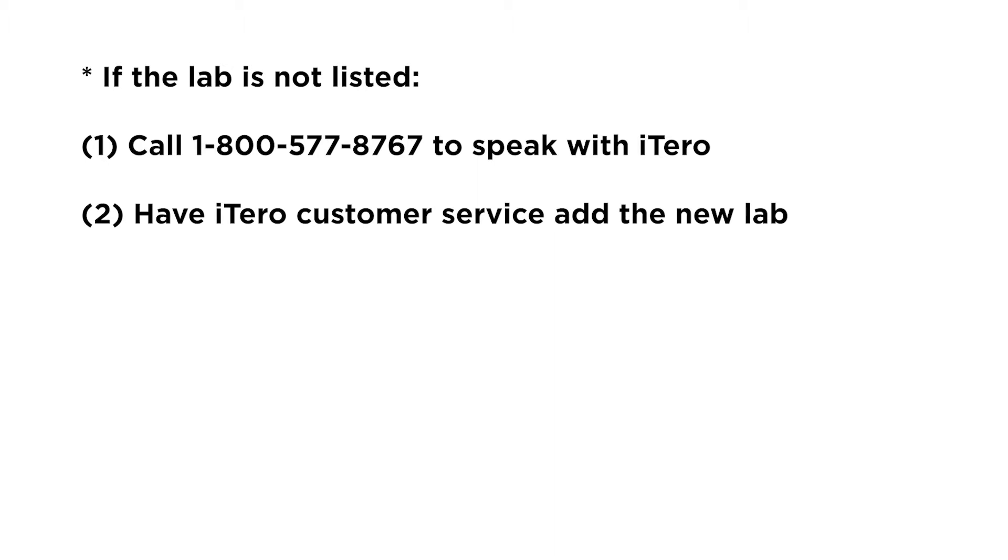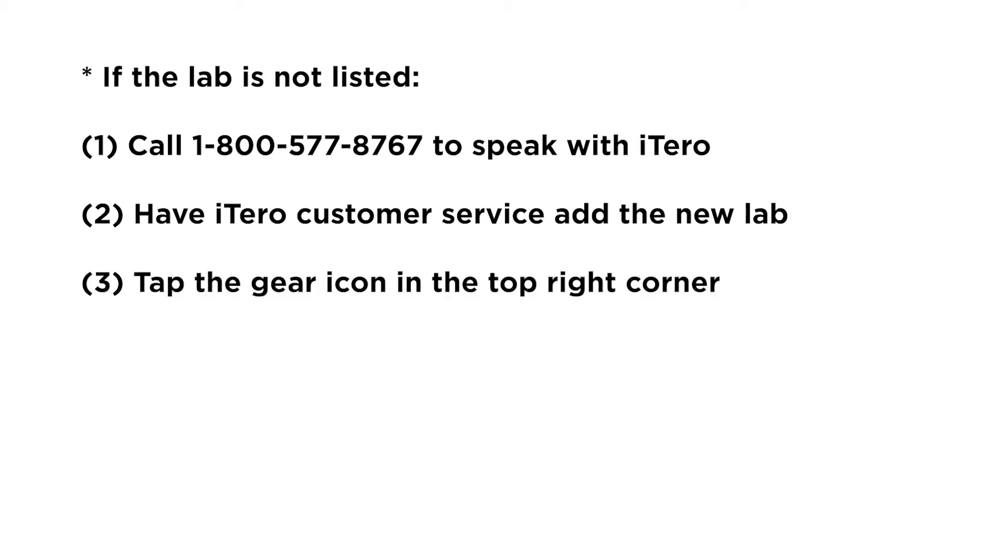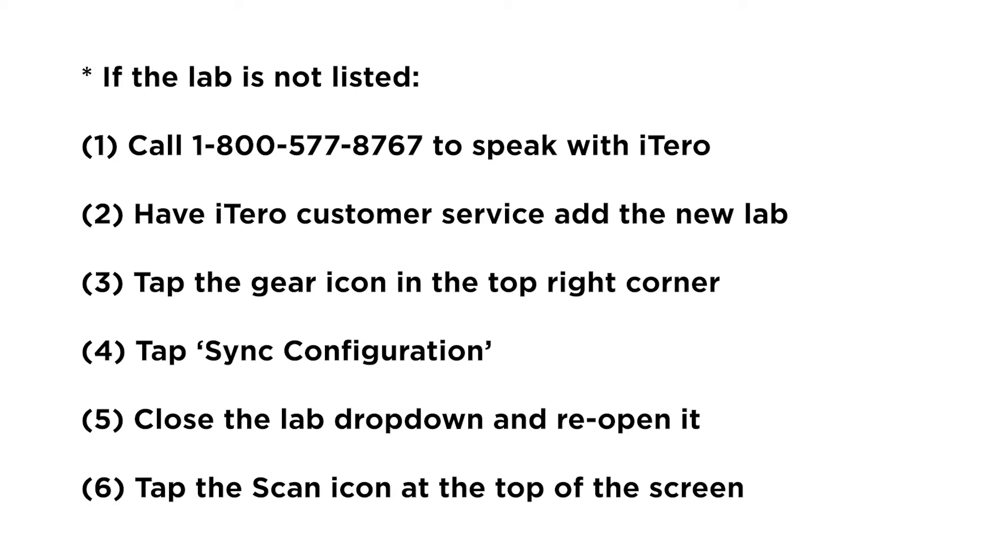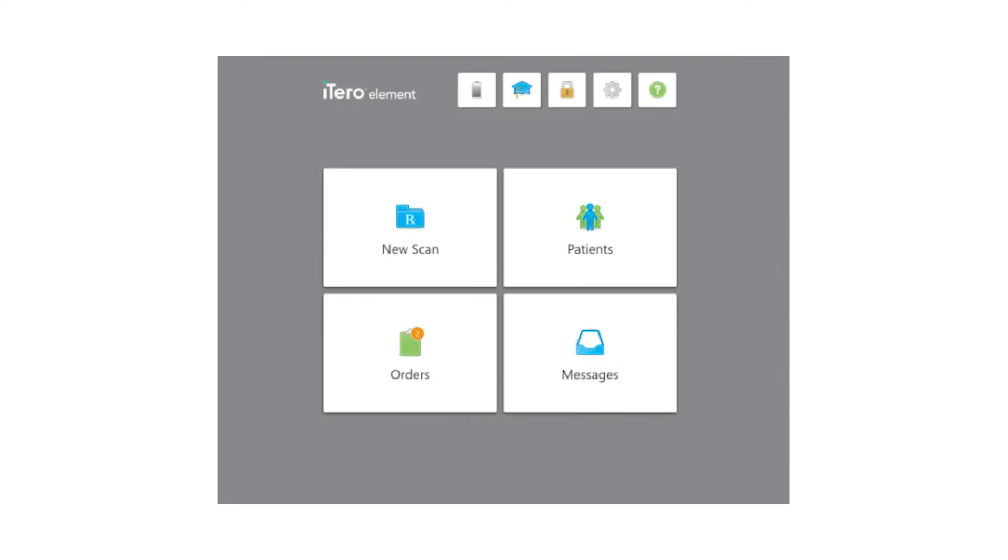Have iTero customer service add the new lab. Tap the gear icon in the top right corner, tap sync configuration, close the lab dropdown and reopen it, then tap the scan icon at the top of the screen.